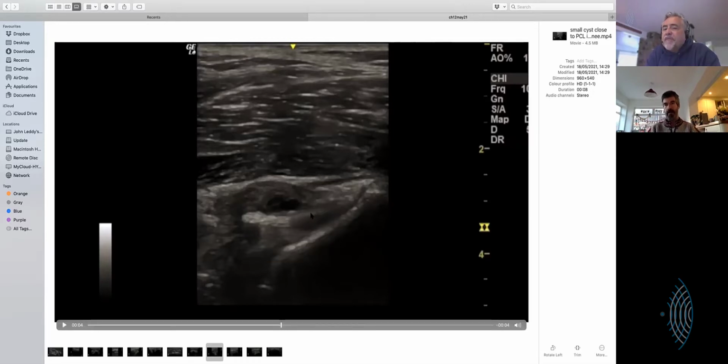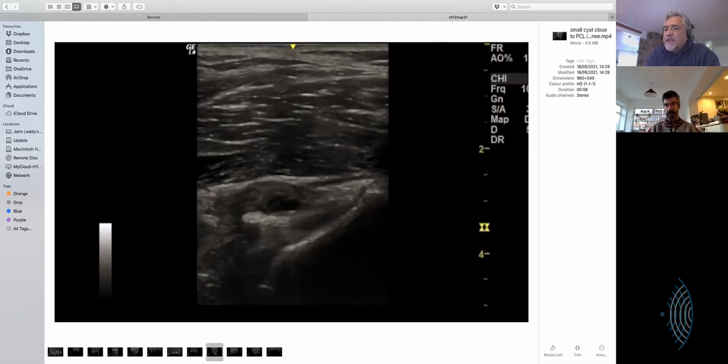Would you say that if I practiced that, I would be able to see that reasonably resolved in 75%, or would you say 90%? Well, sometimes they look very different in different people, but pretty much anyone who's relatively straightforward to scan at that depth, you will see it, and some of them will look more worn, but it's quite easy to get to because you get that. That's the back of the tibial plateau. And then it goes from there, and it just goes like that and back up again.